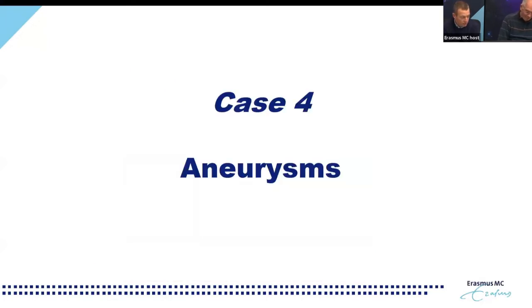Aneurysms. Obviously, you all know aneurysms, you all see aneurysms, and you all struggle with treating them, or perhaps struggle with leaving them alone. Simply because the tools and technologies we do have in the cath lab simply don't match the needs to optimally treat aneurysms. In patients that actually come in with problems related to the aneurysms, because obviously aneurysms per se do not warrant treatment. But this was a patient that had an aneurysm and was in need of treatment.